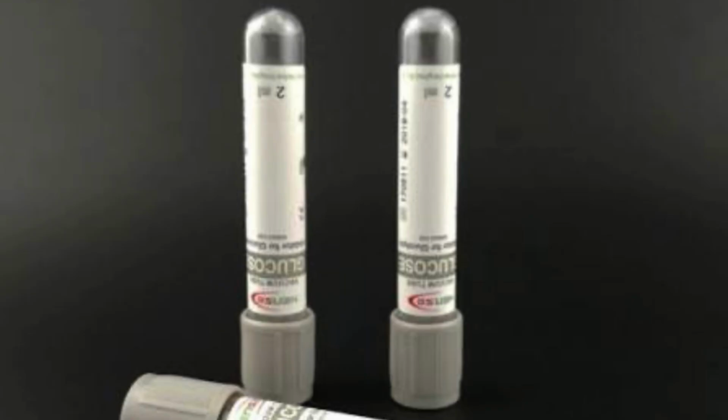For the gray top tube, we invert the tube 8 to 10 times immediately after we receive our blood. We mix the additive with the blood. For the blue top tube, we invert 3 to 4 times immediately after we receive our blood. The red top tube we don't invert because there's no additive. For the gray top tube, we invert 8 to 10 times, and we also invert our purple top tube. The only tube that we don't invert is our red top tube because there's no additive.